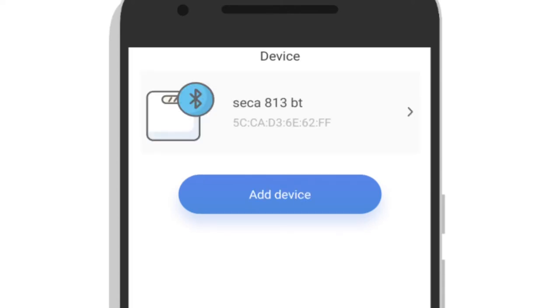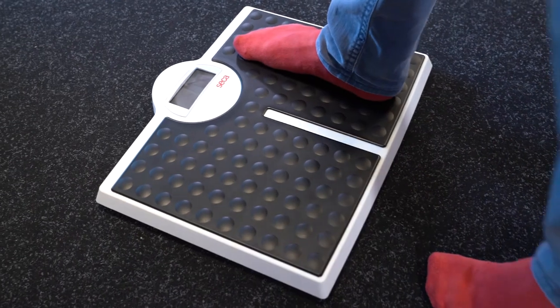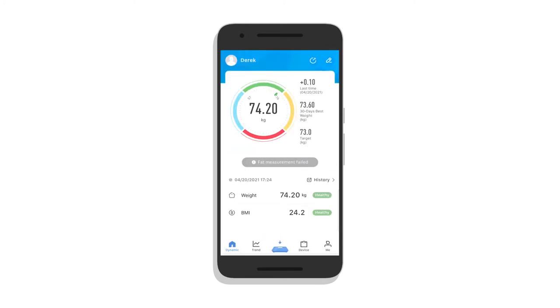To take a measurement, I just click on the scale in the lower center part of the screen. Once I stand on the scale, I'll see that my results are shown live and they appear in the OKOK International app.